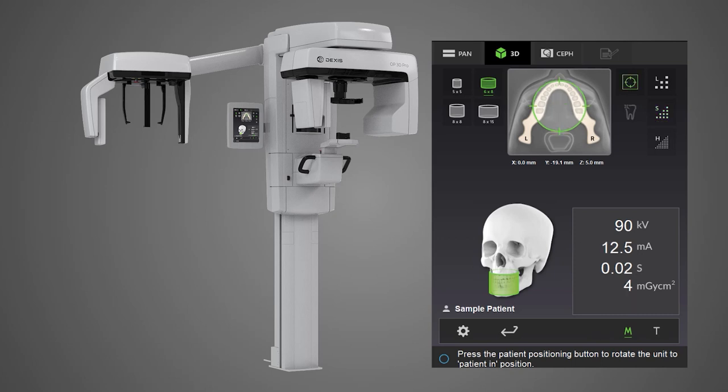The Scout feature is used to ensure proper patient positioning prior to acquiring a 3D image. The Scout image requires significantly less radiation than a 3D scan. Use of this feature helps prevent additional patient exposure due to patient positioning errors.